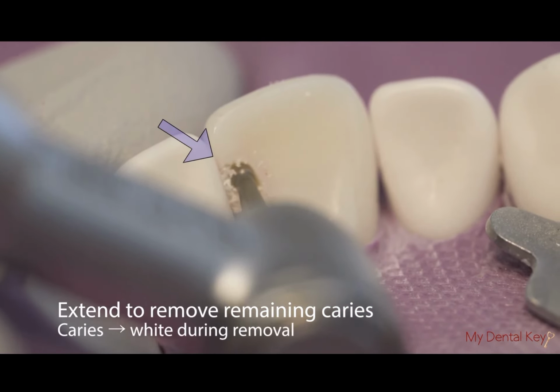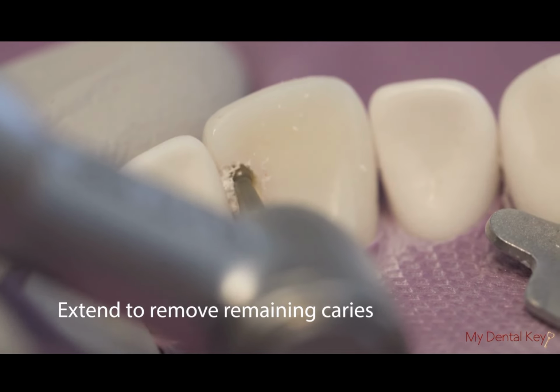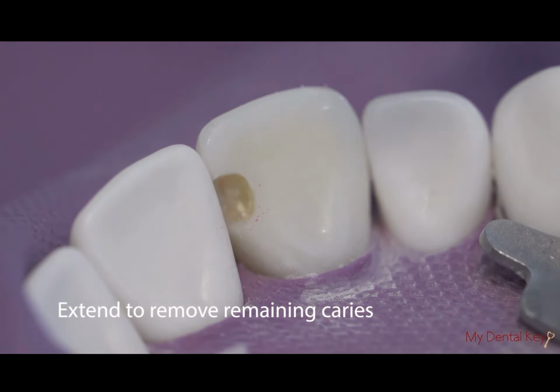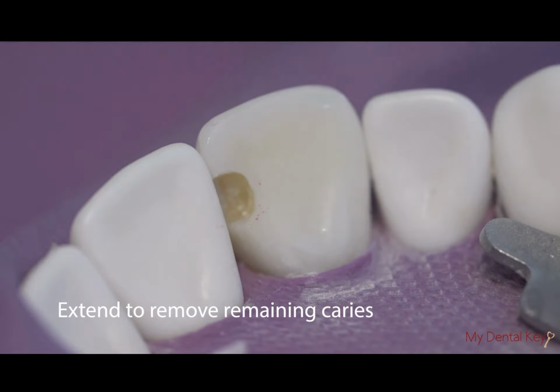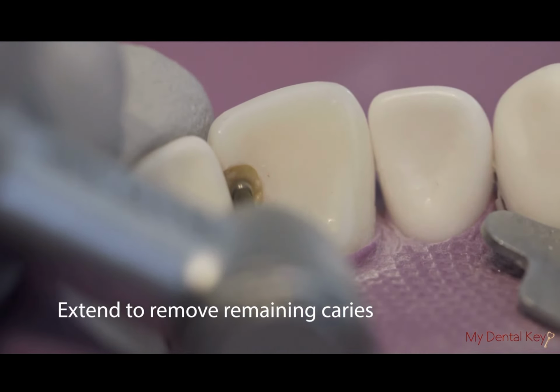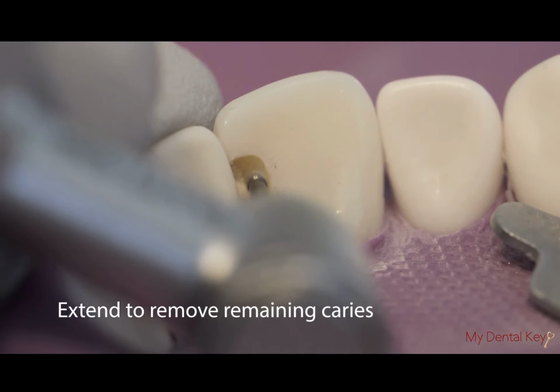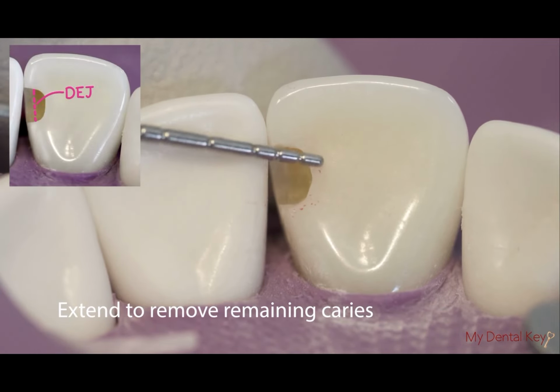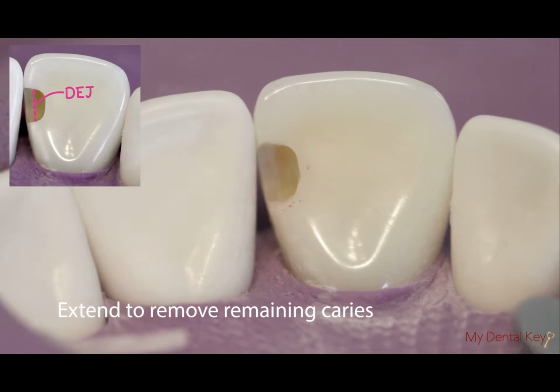You will see here that caries are being removed and they come out as a white powder. You may opt to replace the wedge to prevent iatrogenic damage to the adjacent tooth during the caries excavation process. As you continue extending, make sure that all unsupported enamel is also removed. Note that on this tooth, you will see the DEJ, where the enamel transitions into dentin.